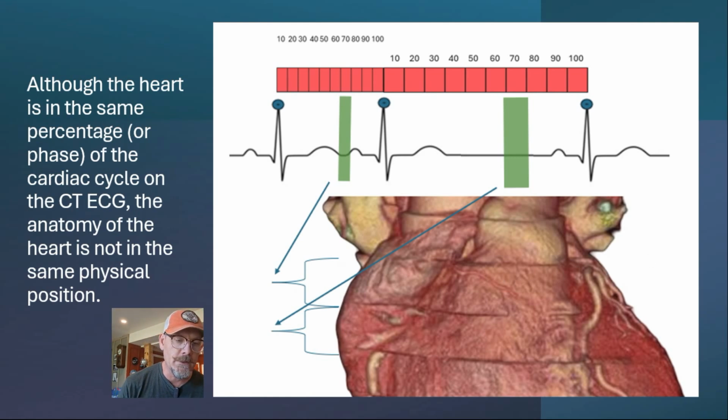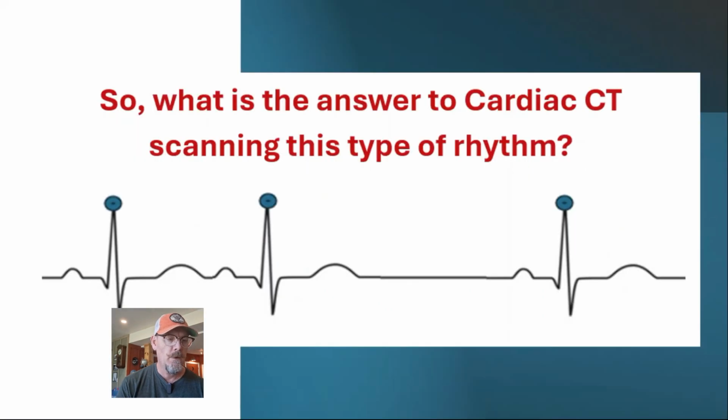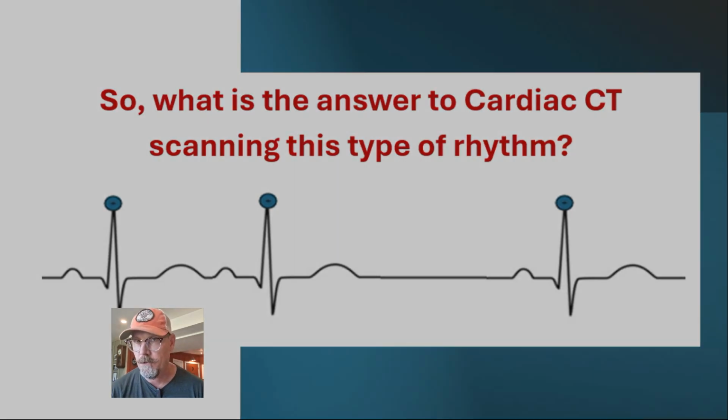So why is that important? This is good to know that in irregular heartbeats and or very rapid heartbeats, that it is good to scan in a millisecond systolic window. And so the question is, what is the answer to cardiac CT scanning in this type of rhythm?